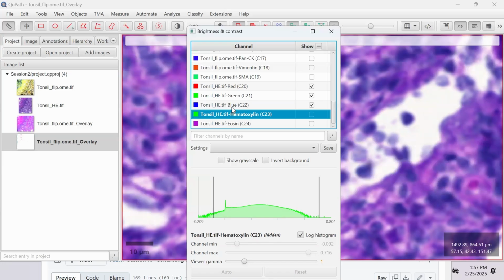Unfortunately, you have to do it. So yes, if you've got cyclical fluorescence or cyclical DAB, this is the method. Unfortunately, you have to do it one pair at a time. So you'd add 1 and 2, and then add 3 to that, and then add 4 to that, and it can be painful. There are scripts on the forum written by me and Mike to do that in a more automated fashion. And if some of my collaborators would ever submit the paper that has been sitting on their desk for 6 months, there'll be a paper about it.